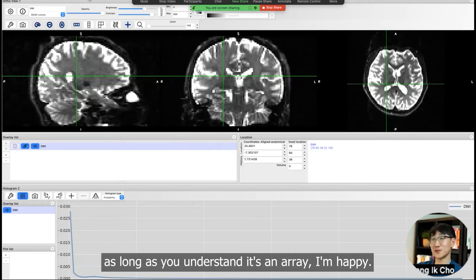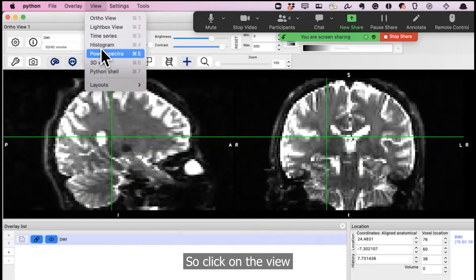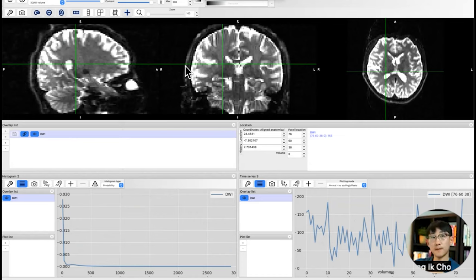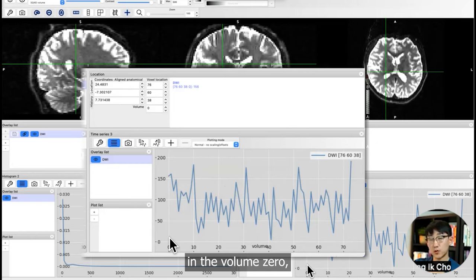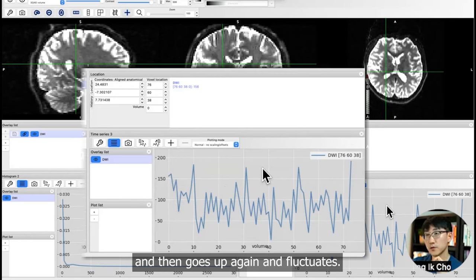Click on View and click on Time Series. Here now you can see the information distribution of different volumes. In the voxel that I'm at right now, in volume zero, which is the first volume, the intensity was 156, as shown here. But it goes down in the next volume, goes up again, and fluctuates.